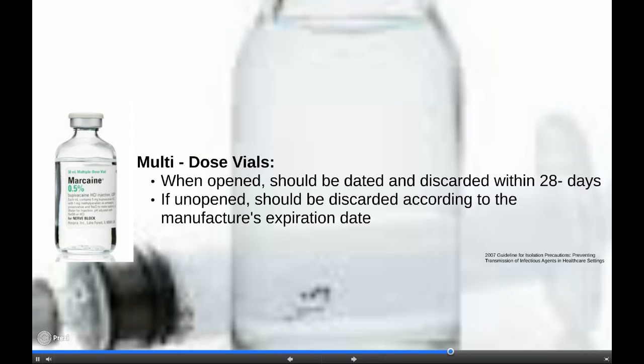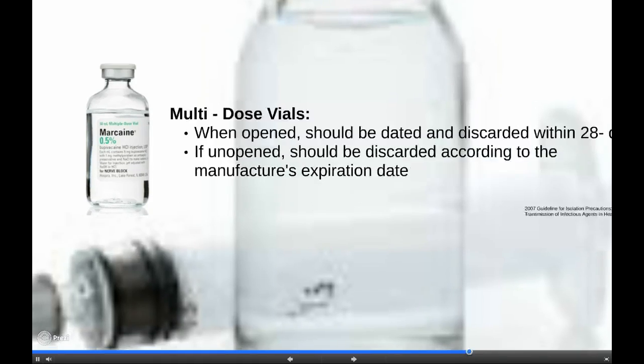We understand that drug shortages exist and resources are limited. However, this is not an acceptable argument for sharing vials between patients. Waste can be reduced by purchasing and using the smallest vial possible. Treating a patient for an HAI, a healthcare-associated infection, is far more expensive than buying vials of medication.